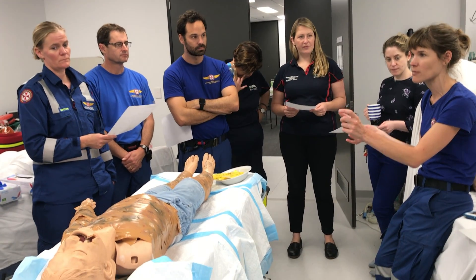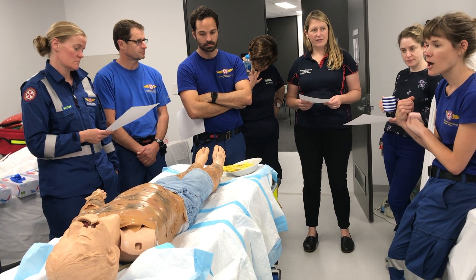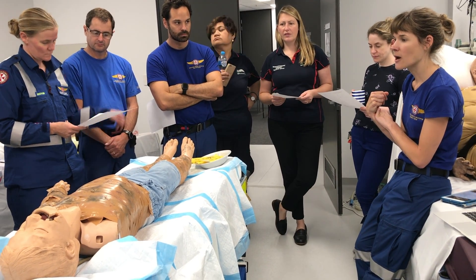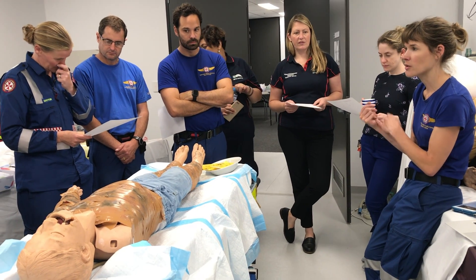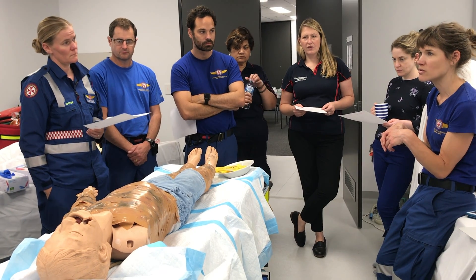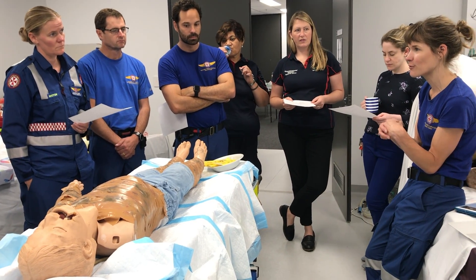You want to go a couple of centimetres — one centimetre below into normal tissue beyond where the burns are to make sure you've gone through. You basically see that things burst apart. That's the sign that you've gone deep enough, and hopefully you'll get some perfusion improvement with that.